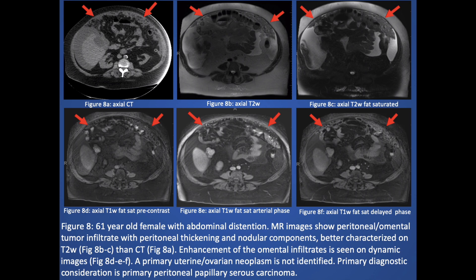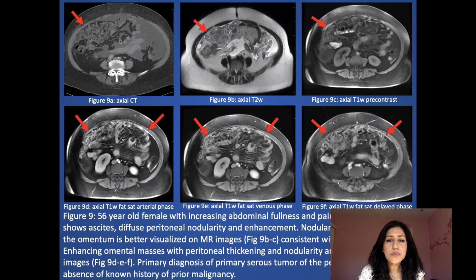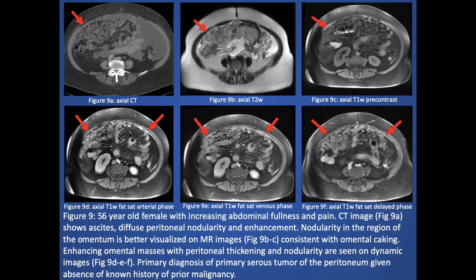Here is a 61-year-old female with abdominal distension. Images show peritoneal and omental tumor infiltrate with peritoneal thickening and a nodular component. A primary ovarian neoplasm was not identified, and the primary diagnostic consideration is primary peritoneal serous carcinoma. Another case: a 56-year-old female with increasing abdominal fullness. CT shows ascites and diffuse peritoneal nodularity, better characterized on MR with omental caking, enhancing omental masses, and peritoneal thickening. Primary serous tumor is favored given no prior history of malignancy.